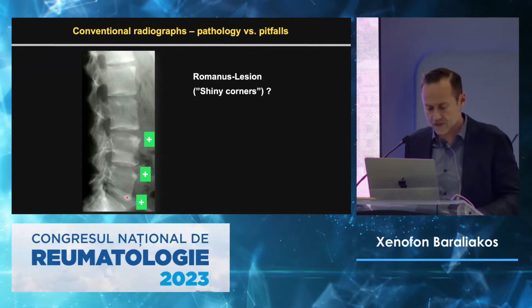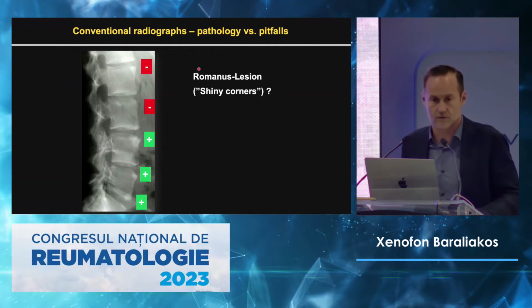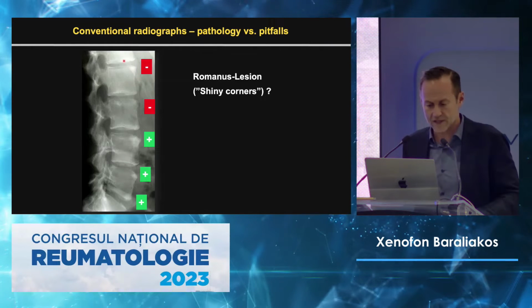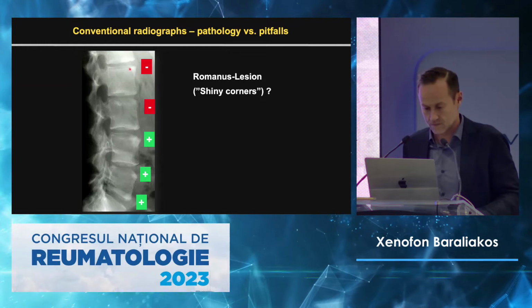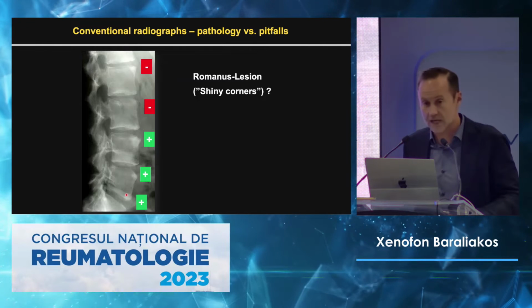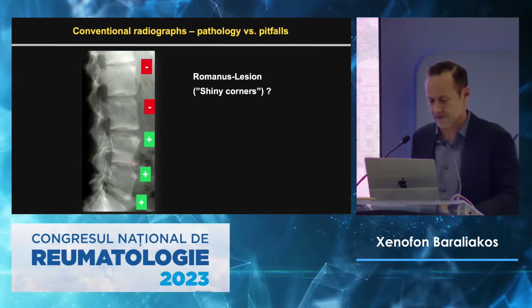The difference from this very low corner to that corner, which is not spondyloarthritis related, is that here we have that hyperdensity directly there where the rib is going along. Okay? Here we have the pelvis, and there is a higher density anyway in the lower part.